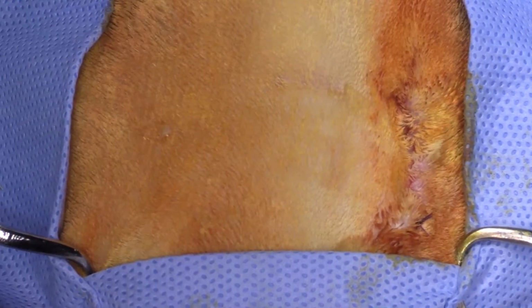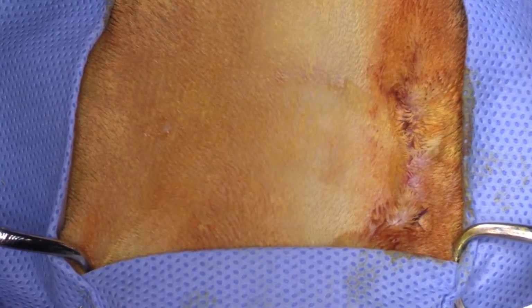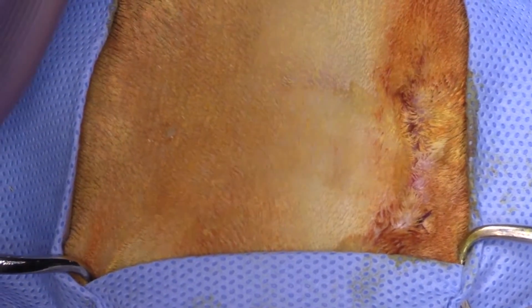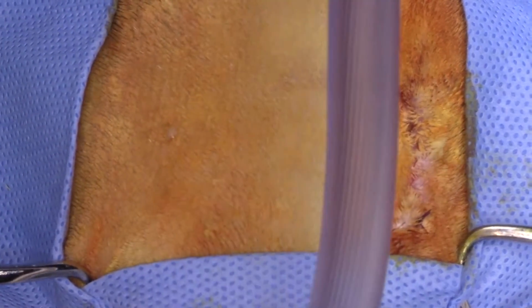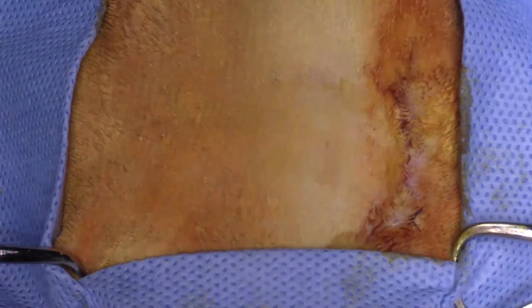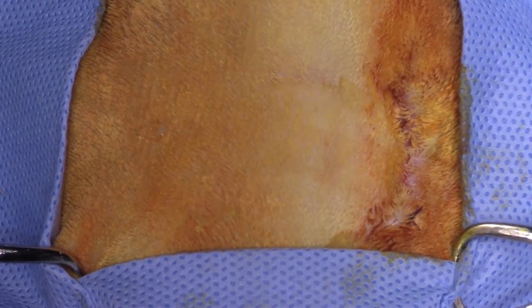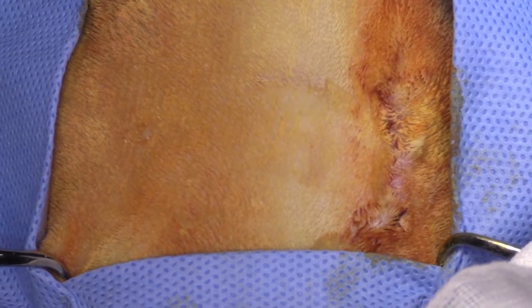All right, we'll switch sides. And I can do the left one. Let's grab that stool out of the way, Janine, please. Sorry for my sniffling. Let's see here. Try to move this over a little bit. Leave it where it is.